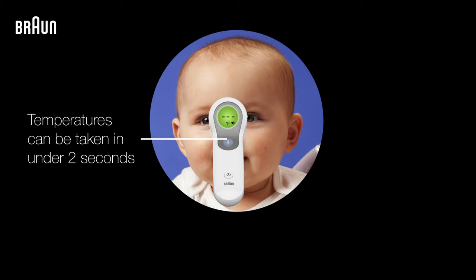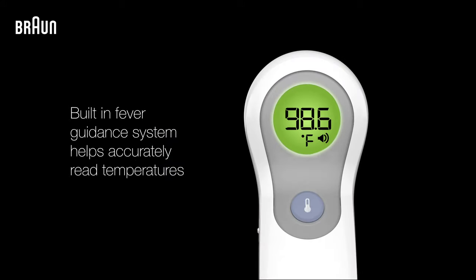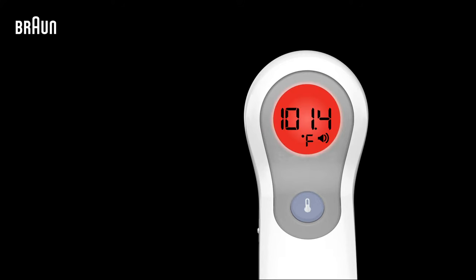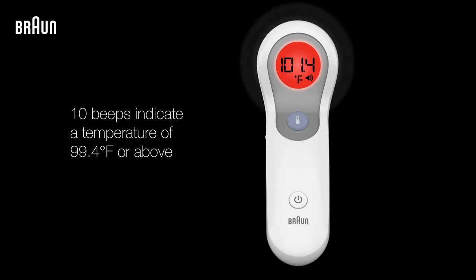Press the temperature button to begin the measurement, which can be made in under two seconds. Once a temperature has been taken, the reading will be shown on the thermometer's display, along with a green, yellow, or red color from the fever guidance system. The thermometer will also beep ten times when it reads a temperature at or over 99.4 degrees.